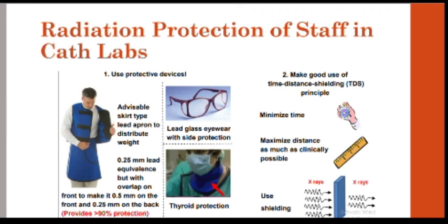Make good use of the time, distance, shielding principle. Minimize time, maximize distance as much as clinically possible. Use shielding.